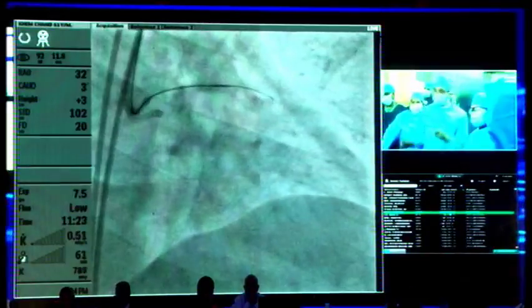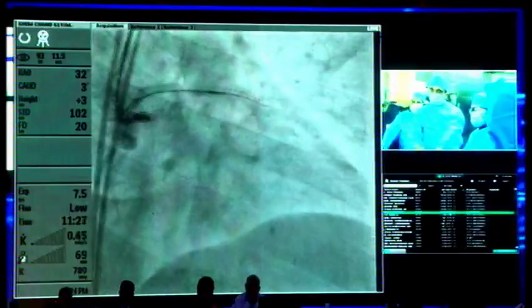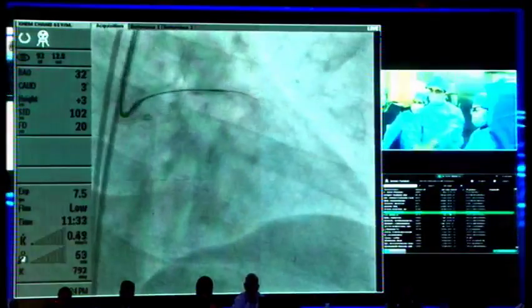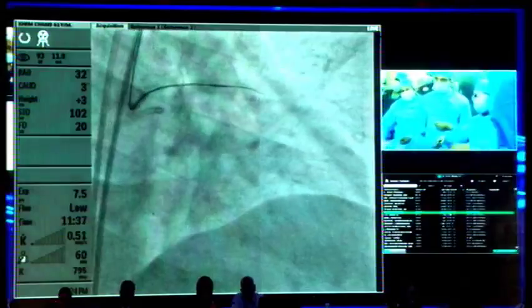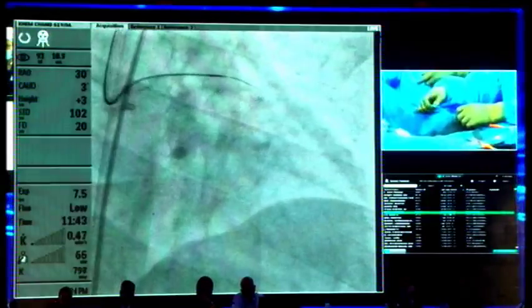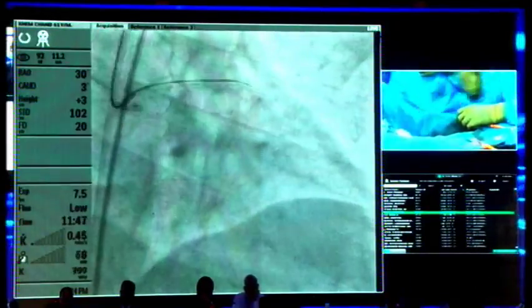Suppose we don't have the Gaia Next series in India. So you have taken the first wire as the Gaia Next 3? No, the first wire was Gaia 2. Then Gaia Next 2, 3. Gaia Next 3. Okay, so we advance, go back to the cranial, and we don't need a stiff wire once we go through. So give me an XTR. We have already crossed the lesion.